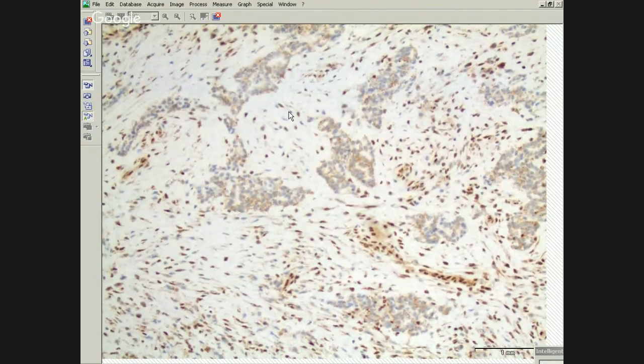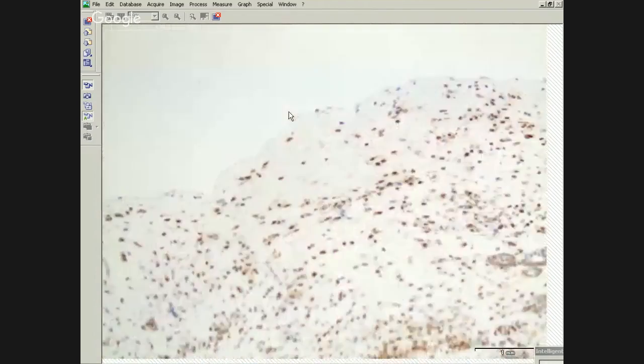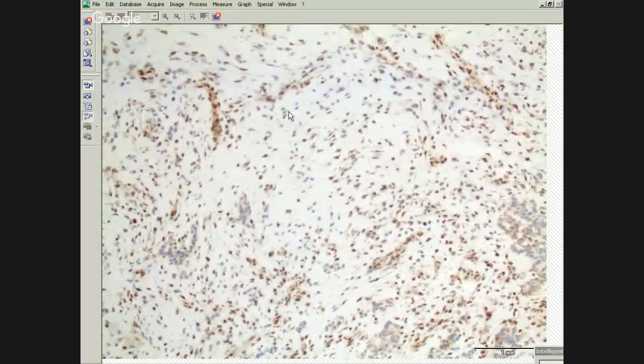And this is something that we're currently looking at to shore up when something is sarcomatoid and when it's not. Again, you don't see BAP1 loss in every mesothelioma, but sometimes it's hard to tell exuberant fibrous proliferation in the background compared to a true sarcomatoid component of a mesothelioma. So if you've got positive keratin staining and loss of BAP1, then that would support that it's a sarcomatoid part of the mesothelioma rather than just entrapped mesothelial cells in fibrous tissue around the background. So, things to look forward to.